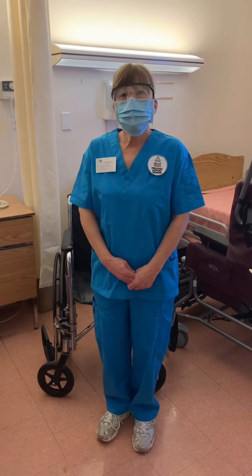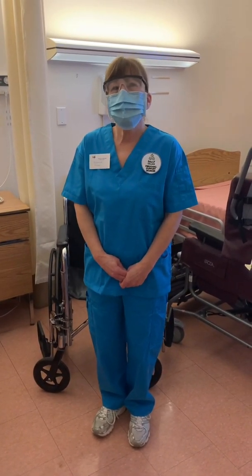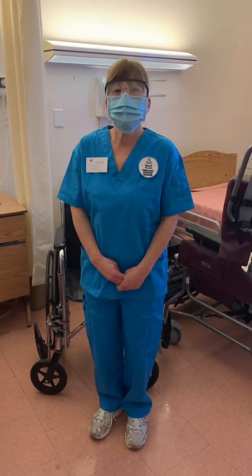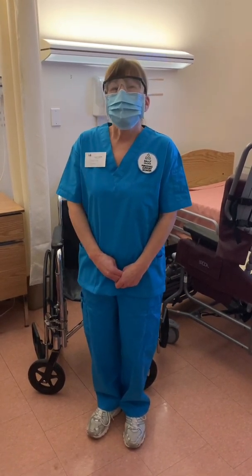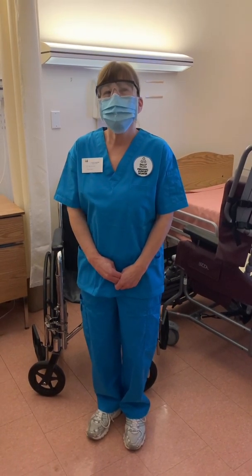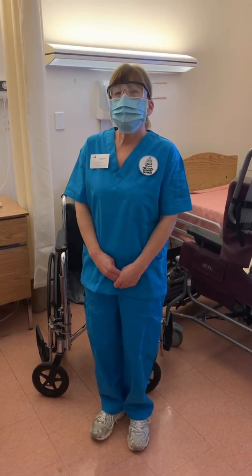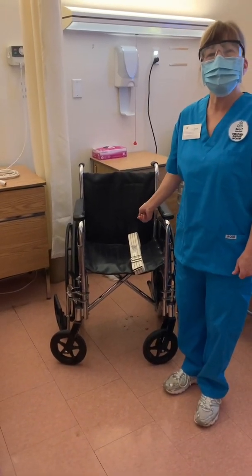We will assume that I've already had a report from the RN on duty and that I have reviewed the client's care plan. For the purposes of this exercise, we are in a facility, therefore we will refer to the client as a resident. And in this facility, we are able to address them by their first name. The other thing to note is that we will assume that in the care plan, the resident has a care plan to use a transfer belt, which I'll be using today.